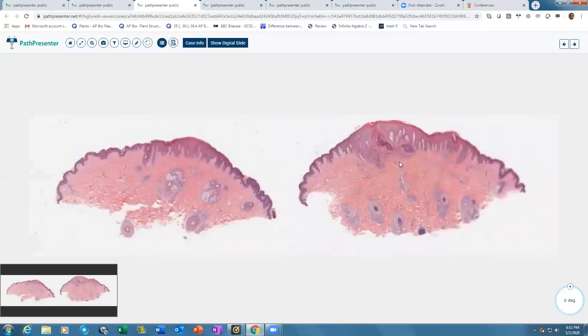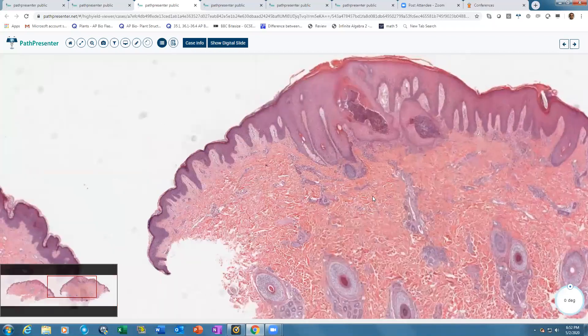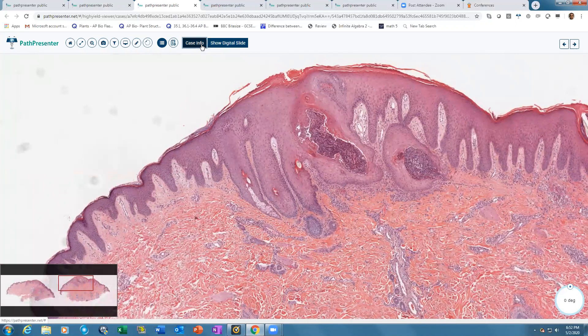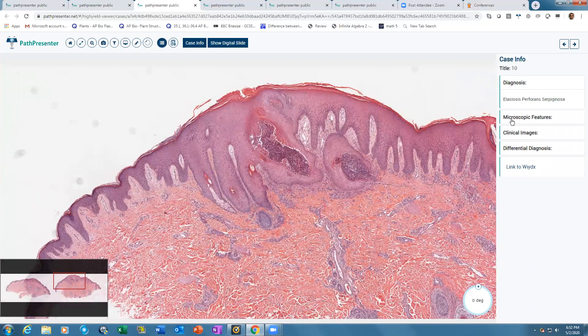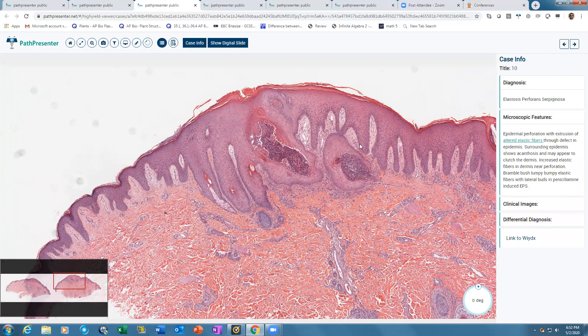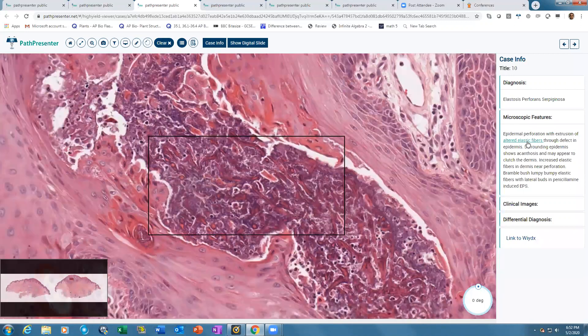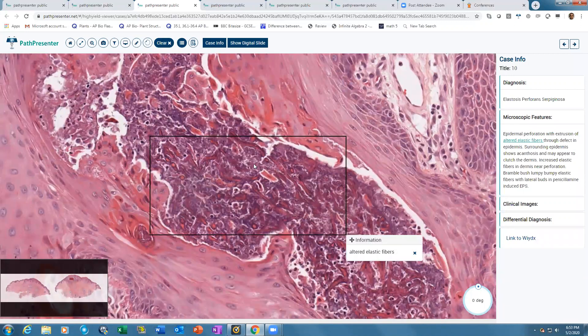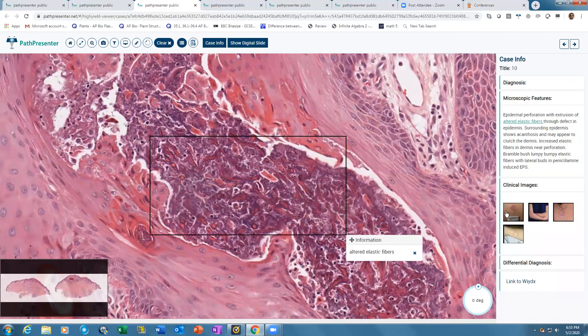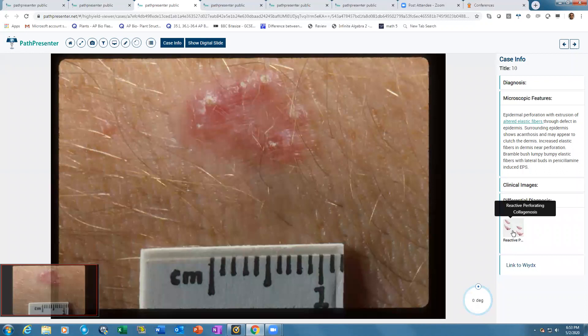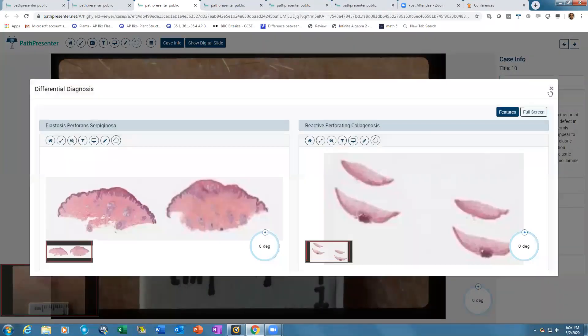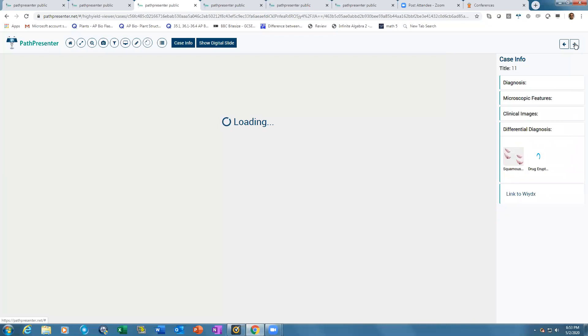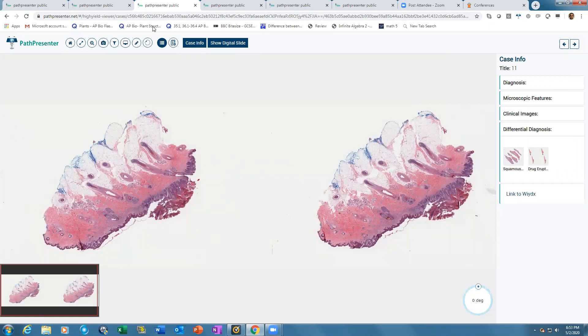They can first make up their mind about the diagnosis, then click the case info button which gives the diagnosis and microscopic features. Like teaching on a multi-headed scope, these features are linked to the slide. Click highlighted features to zoom into the slide and show that feature. Associated clinical images and differential diagnosis slides open side by side for comparison.